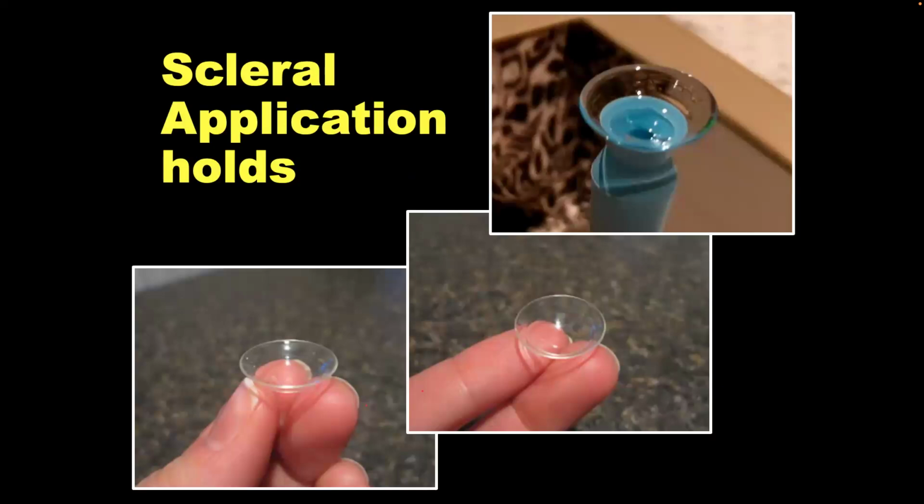So I think you are pretty much well experienced scleral lens fitters. And this is just a reminder on what we can do to place that scleral lens on the eye, just using a DMV, tripod, or two fingers.